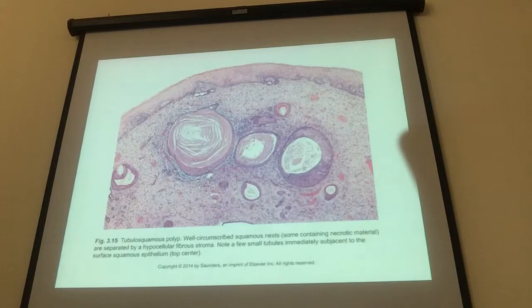So the location will usually be vaginal, not cervical. Squamous dysplasia has not been described in this lesion. So there is not significant nuclear atypia or koilocytotic change.